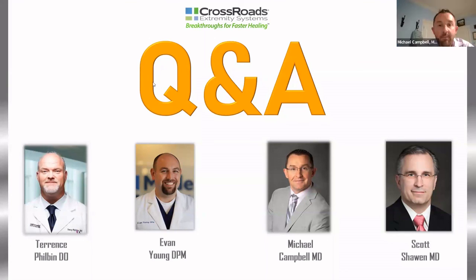So really, the staple nomenclature for Crossroads can be a little confusing if you don't know what it is. So I'll just kind of back up. Usually they talk about a 15 or an 18 staple or a 20 staple, and what they're referring to is the bridge length, the distance between the tines. Then the other numbers that they throw out are the length of the tines, and so really the 15 or the 18 bridge length is going to be determined by which plate you choose. So for a really small petite foot with a small cuneiform, having that 15 is advantageous. It just keeps the construct 3 millimeters tighter.